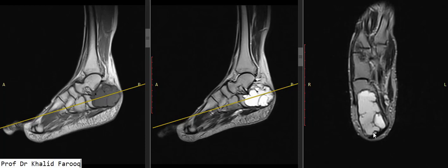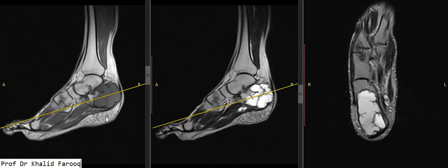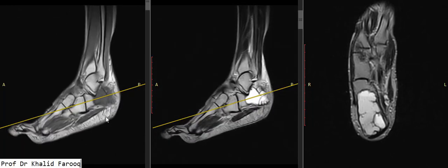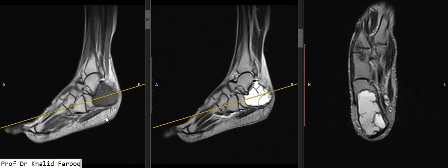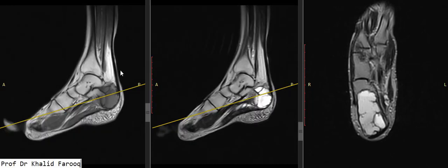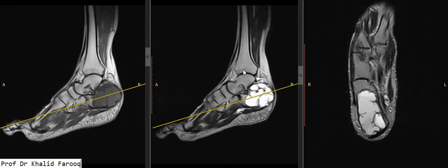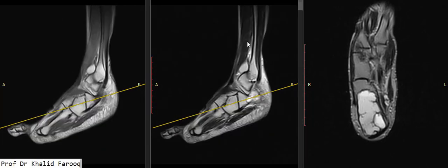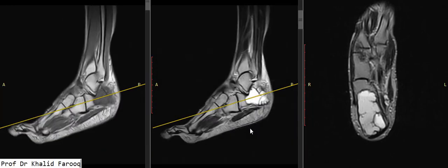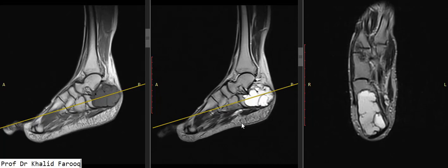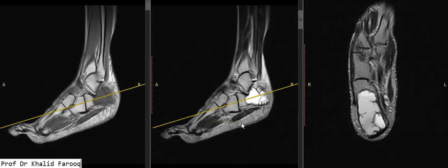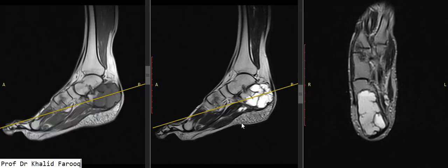The cortex is intact with normal surrounding soft tissue. There is no pathological fracture in this case. The tendon of Achilles appears normal, while the visualized portion of tibia, talus, and fibula, including the remaining small bones of the foot, are unremarkable.